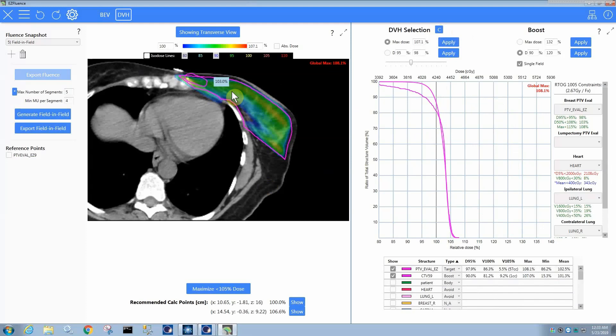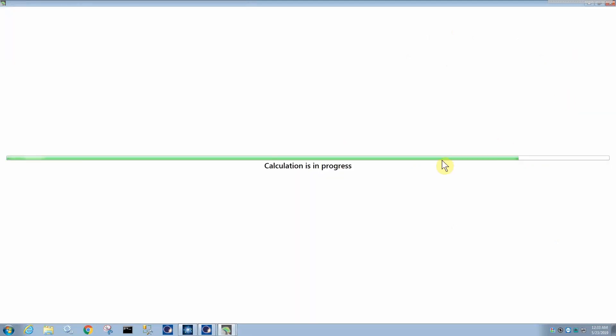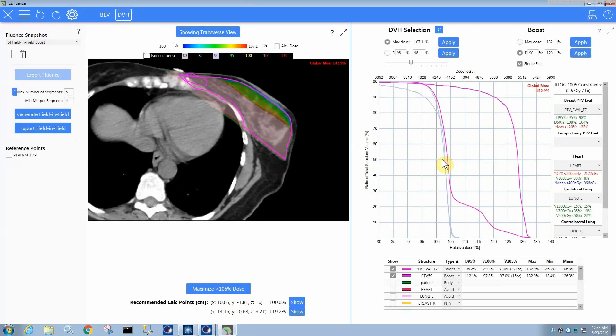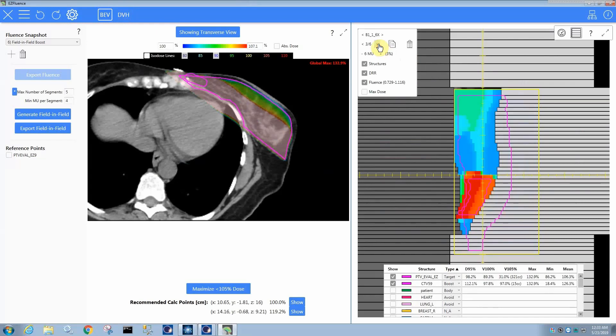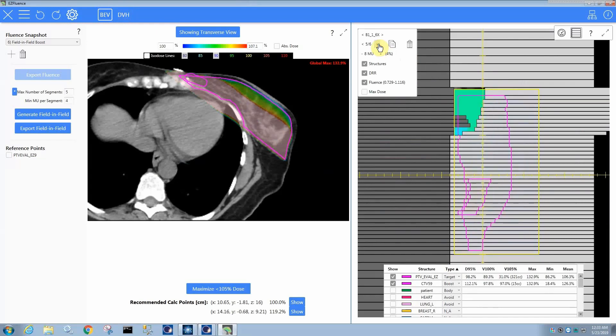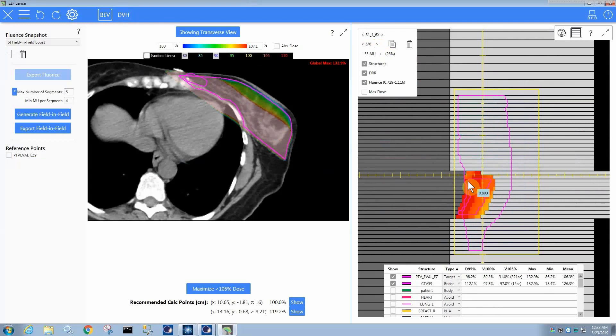And then, if I now apply the boost at this point, then it's going to add a field and field subfield that's going to accomplish that boost. So, let's see how it changed things. So, now instead of five subfields, I have six. So, that is something that's maybe a side effect where the one subfield that is added is only in the part of the field that hits the target or at least gives a reasonable amount of dose to the target.